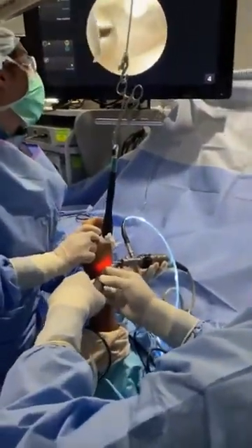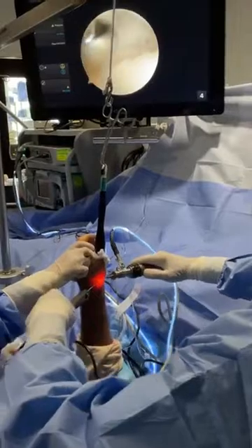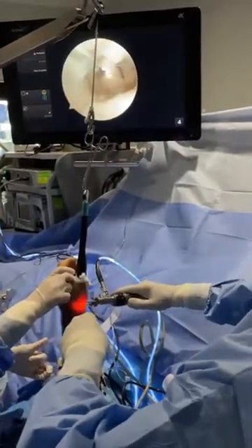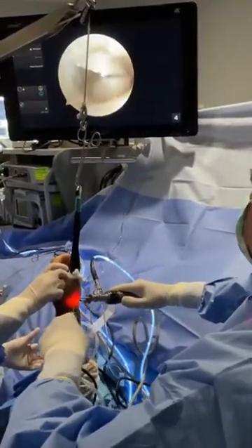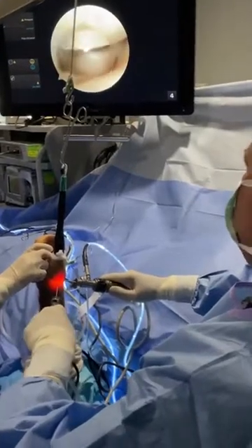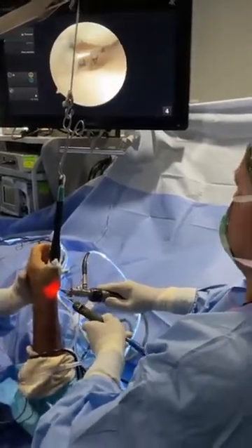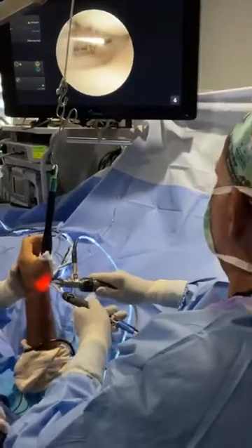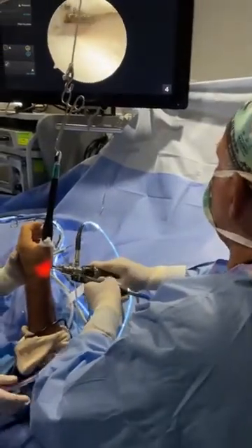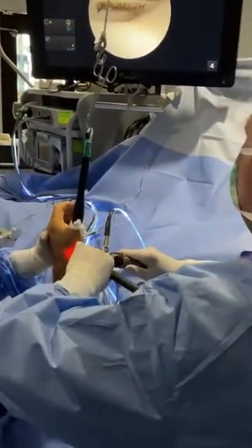Can you explain what you're shaving away? This is the inflamed synovium — what causes the pain is this synovitis. You see this in any joint, whether it be the knee. After an injury you get a swollen joint — that's the synovium, which secretes the synovial fluid, the lubricating fluid in the joints. The synovium can get very inflamed and secretes cytokines, which are responsible for the brain recognizing it as pain. Already most of the synovitis is resected.